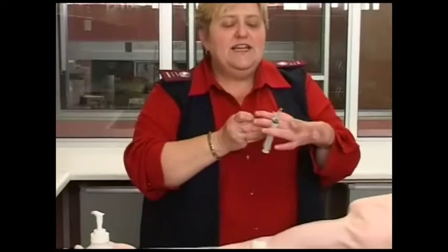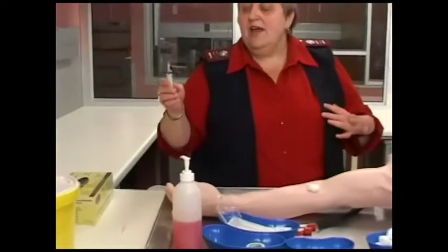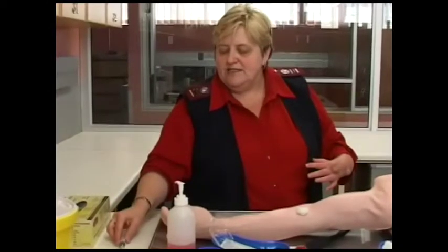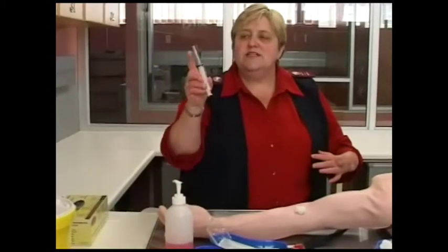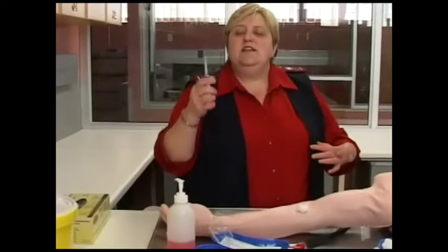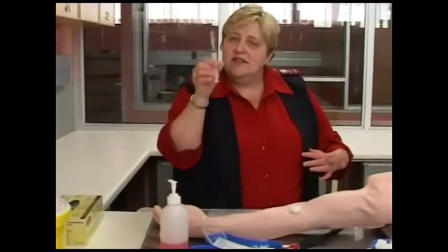If you have a needle and you don't have a sharps bin with you, you need to recap using one hand. Put the cap on a stable surface and insert the needle into the cap with one hand so it is recapped. Then carry the needle and syringe like that until you get to a sharps bin and discard the whole syringe.